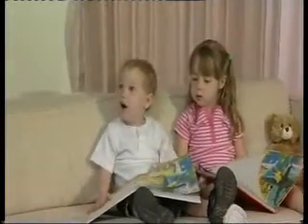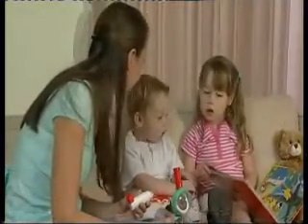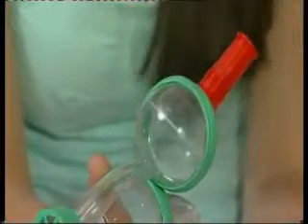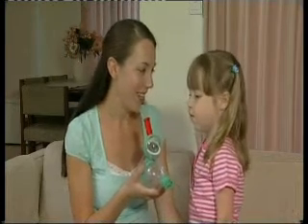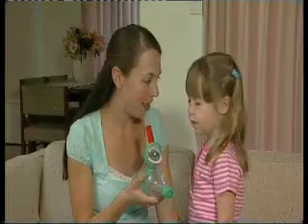Introducing the Funhaler, the easy and fun way to administer asthma medication to your child. This specifically designed asthma spacer is functional in delivering medication and assists your child in developing correct breathing technique. The Funhaler has a unique incentive module that encourages your child to use the spacer more effectively by providing an incentive for correct use. It is durable, easy to clean and has been clinically tested.